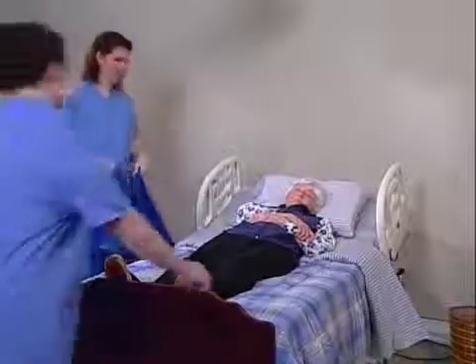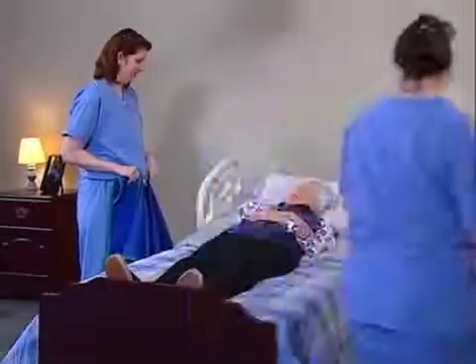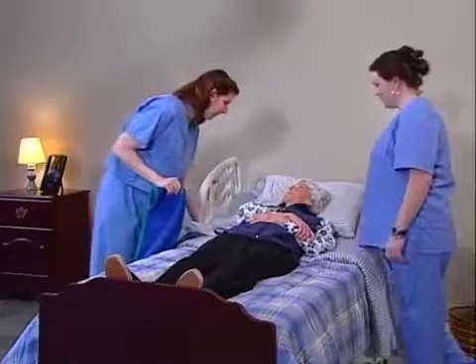Before you attempt any kind of lift, make sure that you understand the resident's limitations and their ability to assist the transfer. It's a good idea to communicate with the resident throughout the process. If you explain each step as you work through it, your resident will learn the routine and become comfortable with it.